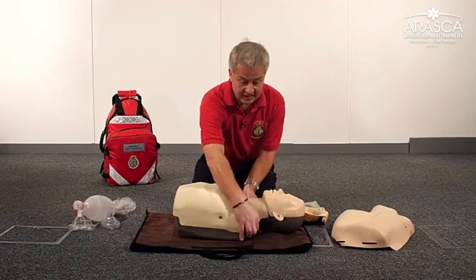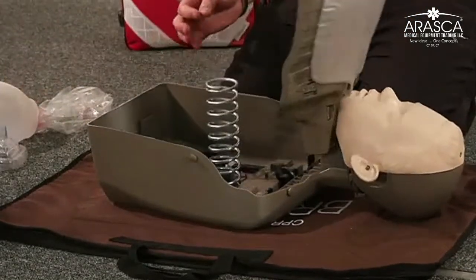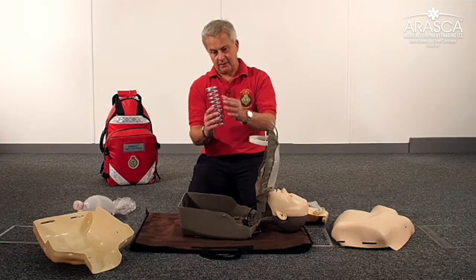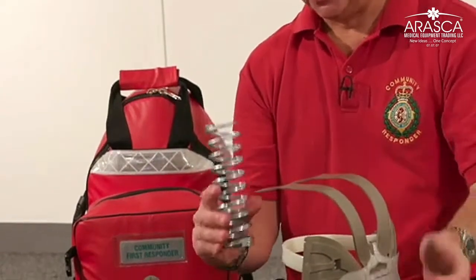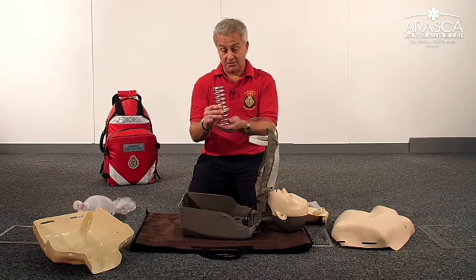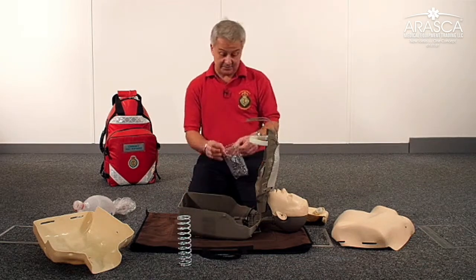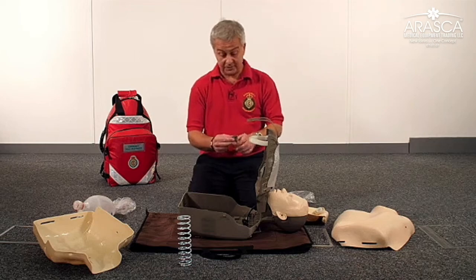Remove the adult chest skin, then open the internal chest piece to expose the spring and pull the adult spring out. This spring requires 40 kilograms of elastic force to push the chest down 5 to 6 centimetres. Published studies suggest that is the correct force needed for the average adult person. You now need to replace that spring for one which is more representative of a child or a young boy of 10 to 12 years old.